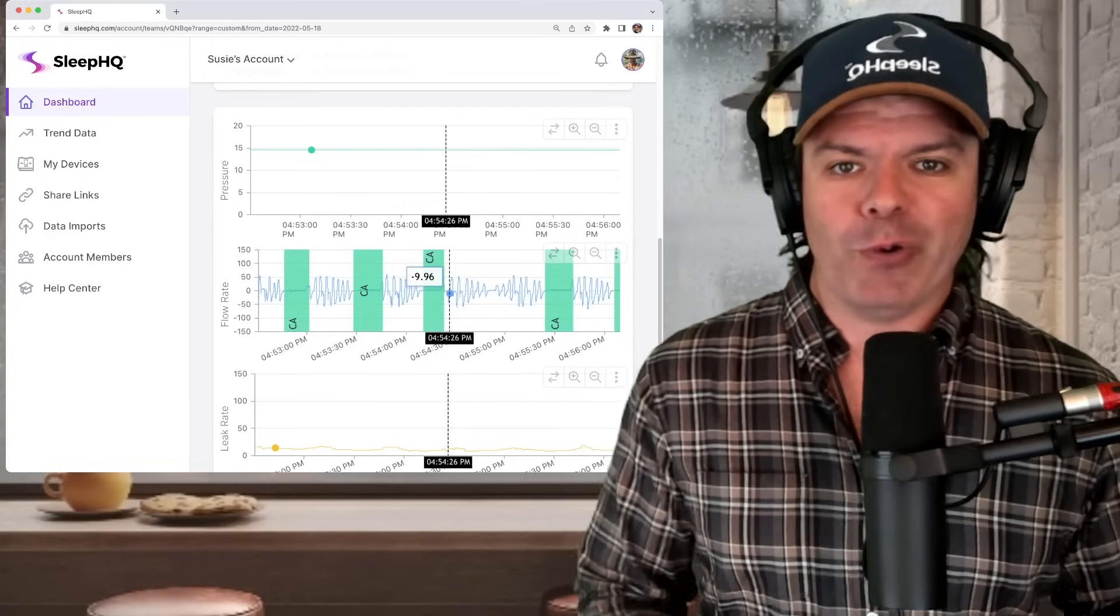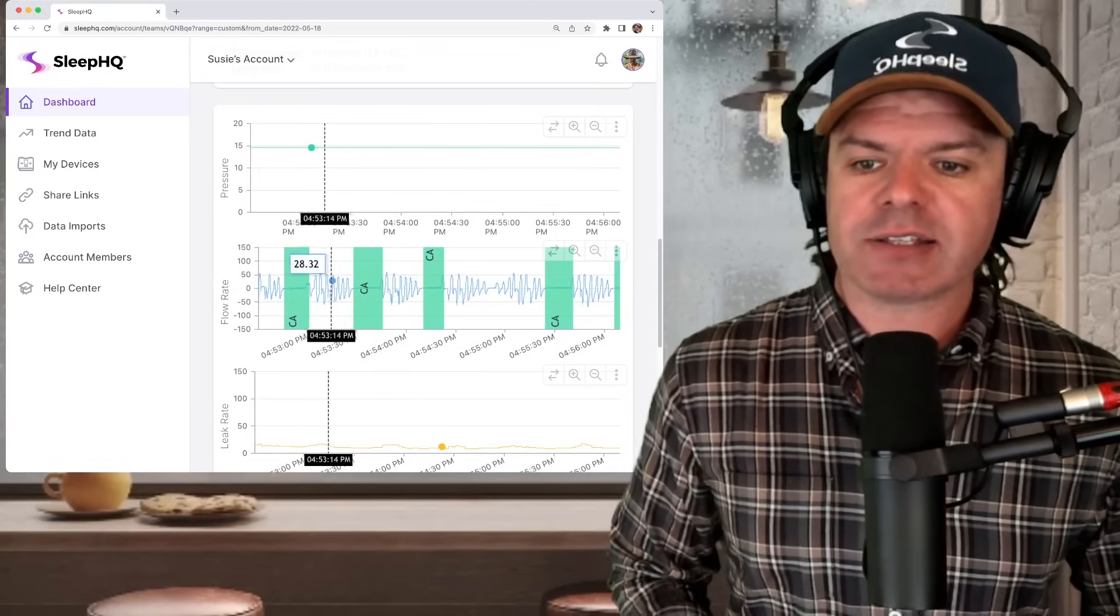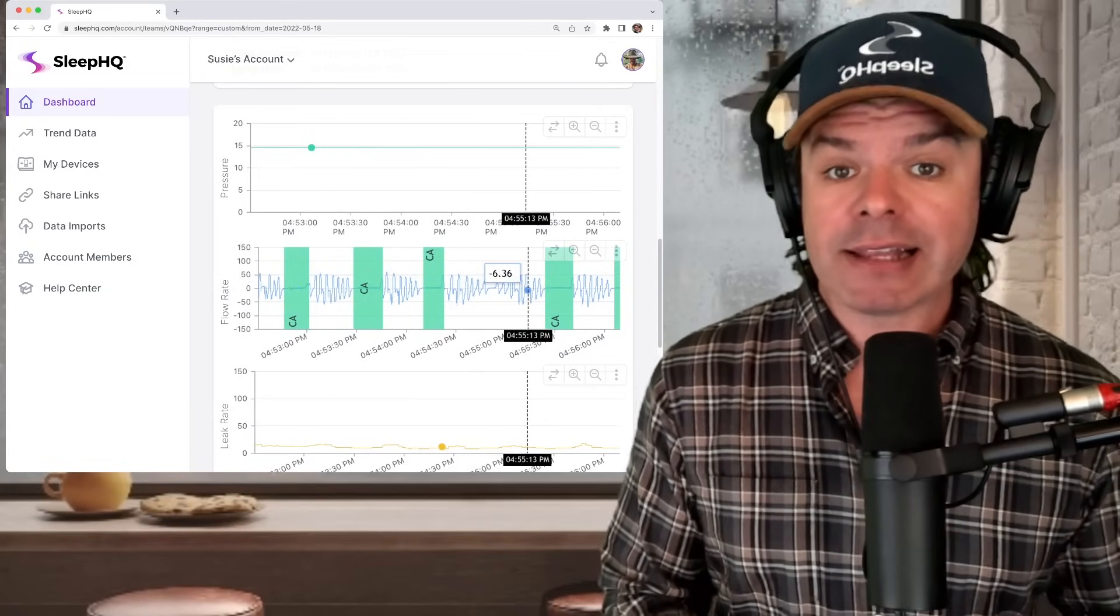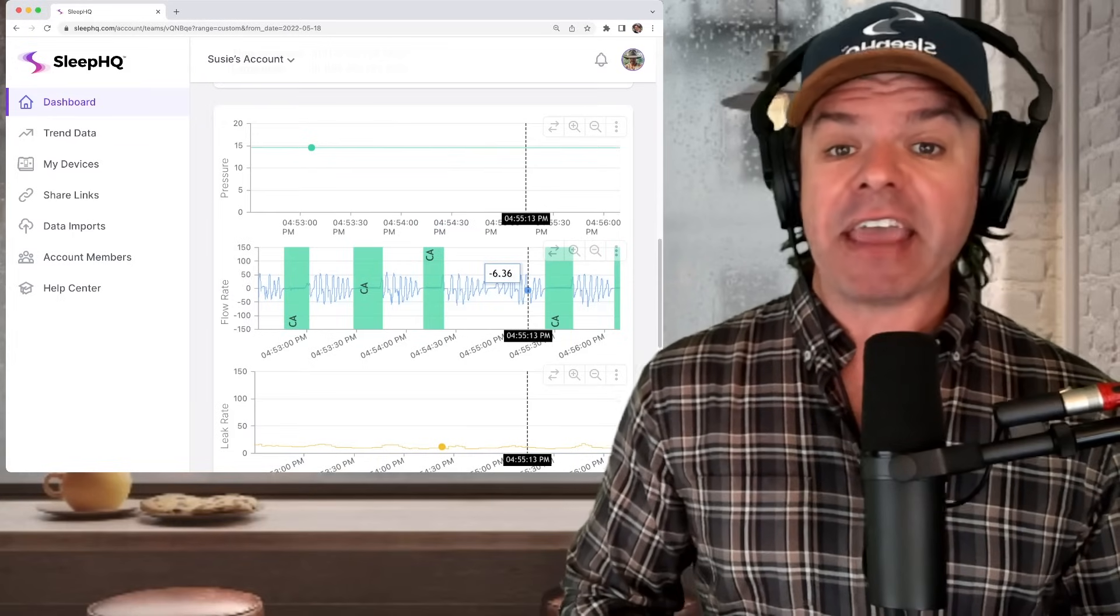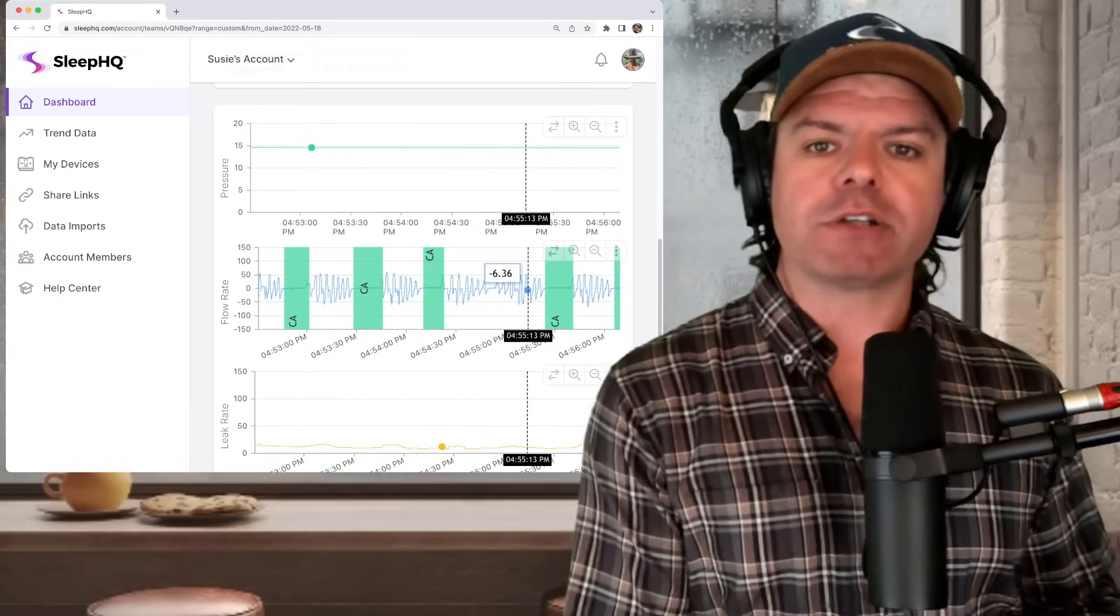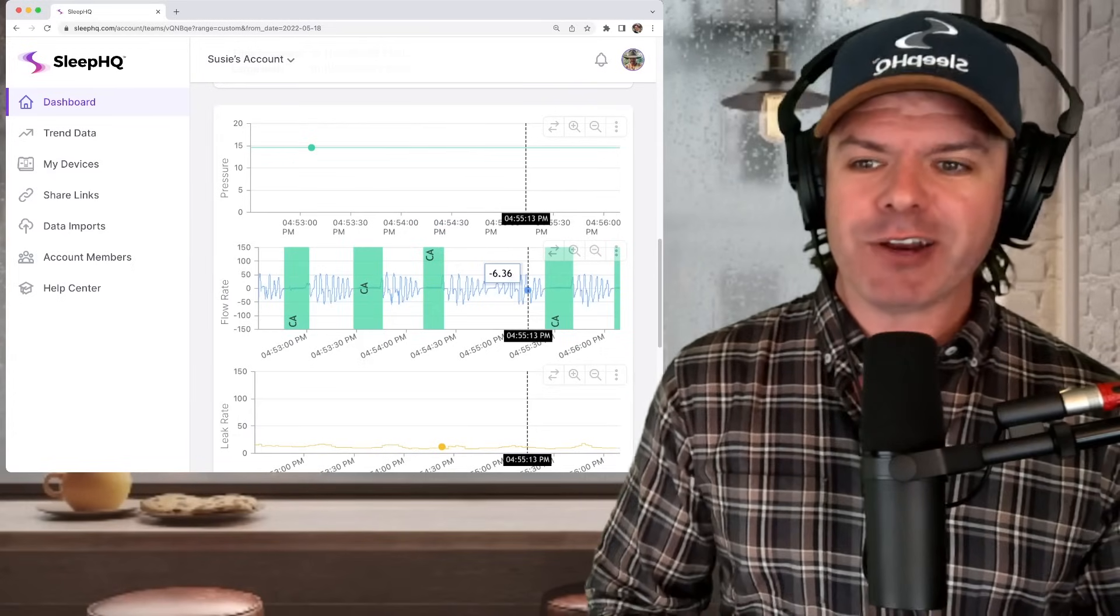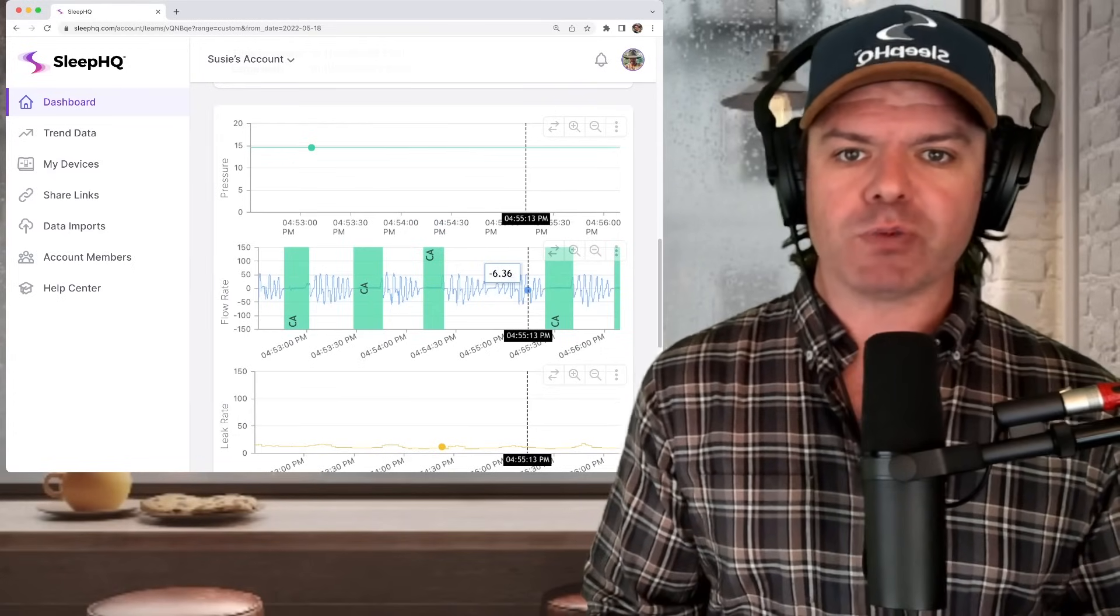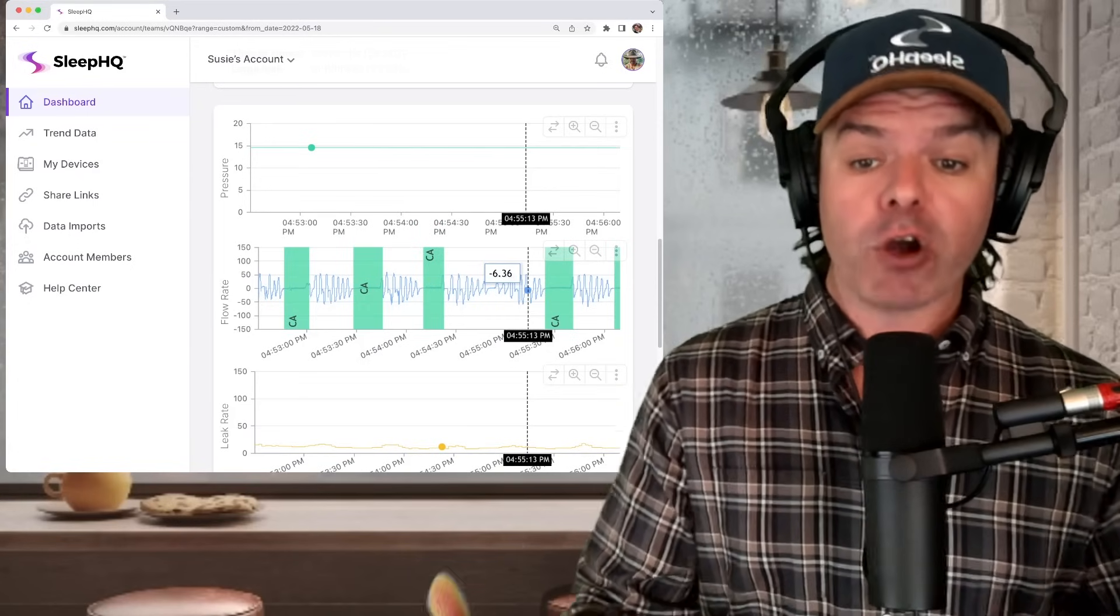Well, no. And I'll tell you why. All these events here, CA CA CA CA, are clear airway events, meaning the airway is open. It's not blocked like with obstructive sleep apnea. So increasing the pressure isn't going to change anything because we're not forcing air past any obstruction. Airway is open.